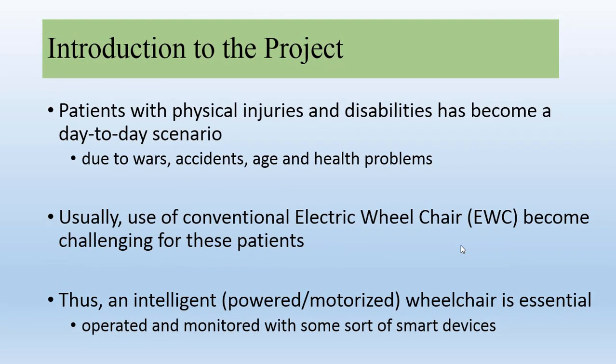Introduction to the project. We know that patients with physical injuries and disability has become a day-to-day scenario due to wars, accidents, age, and even health problems. Usually, use of conventional electric wheelchair for those patients become very challenging. Thus, we are in need of an intelligent, powered, motorized electric wheelchair which can be operated and monitored with some sort of smart devices.